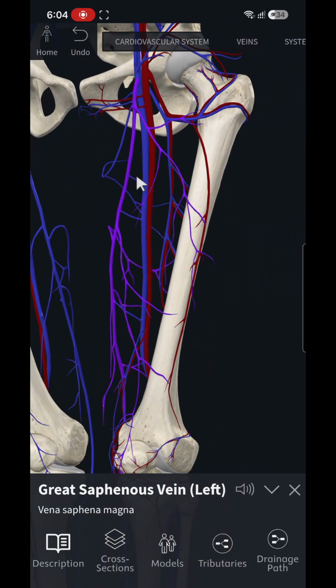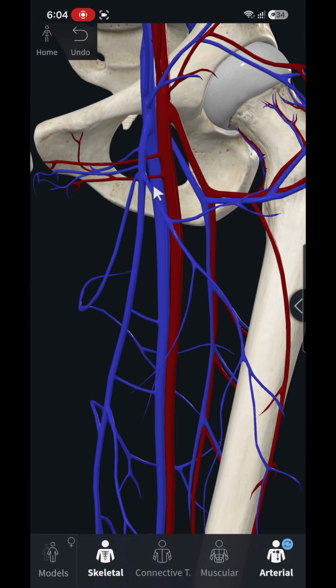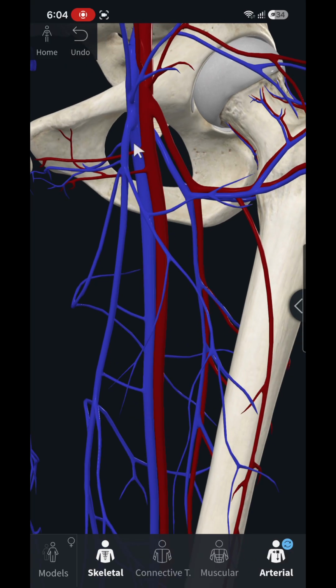Okay, so here we have the femoral vein and deep femoral vein. It's nice to note that here in this section we can view a Mickey Mouse sign on the ultrasound, right, having the femoral vein as the head of the Mickey Mouse sign, and then the great saphenous is, let's say, the medial ear, because here on the left leg it's going to be on the right.